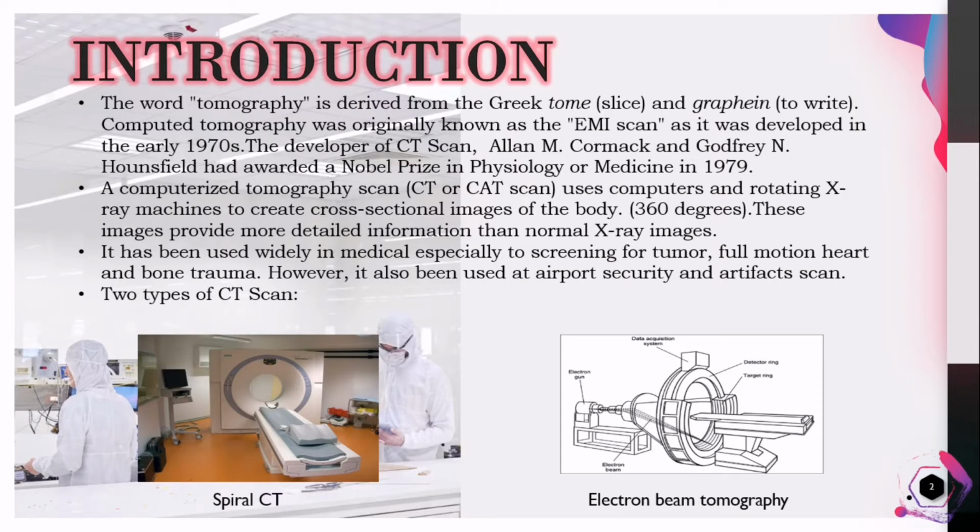The introduction. The word tomography is from the Greek tom, meaning slice, and graphing, to write. Computed tomography was originally known as the EMI scan and was developed in 1970. The developers of the CT scan are Alan M. Cormack and Godfrey N. Hounsfield, who were awarded the Nobel Prize in Physiology or Medicine in 1979.